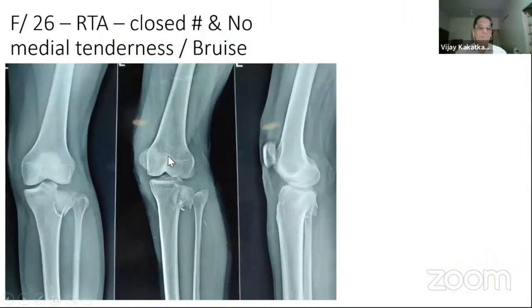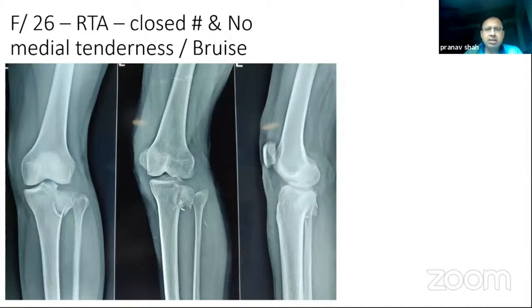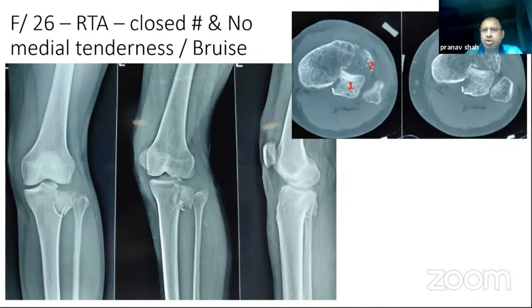We start with this simple case. She's a 26-year-old female who had a road traffic accident. It was a closed fracture. There is no medial tenderness, no medial bruise. These are X-rays, AP lateral and oblique. As we can all see, there is a lateral condyle fracture. The CT scan shows at least two fragments — one anterolateral and one posterolateral.